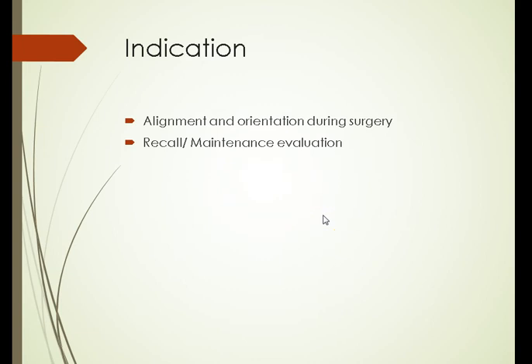It's a great tool also, if you're not really using PA for measuring length, and distortion is such a big part, you're worried about it, at least PA is very good intraoperatively when you're just looking at the alignment and the angulation.